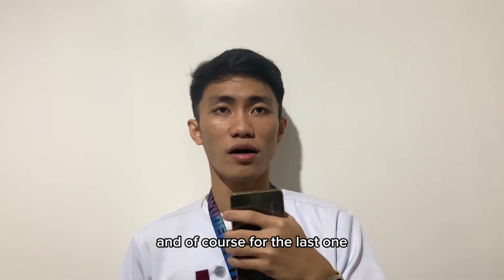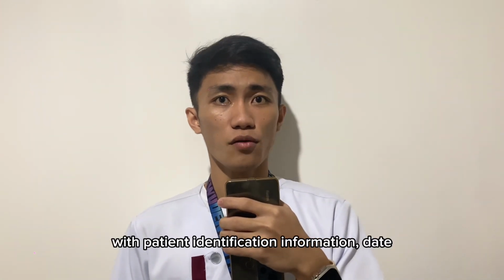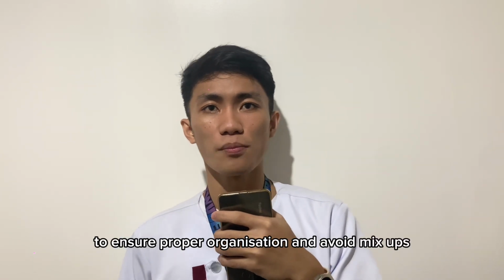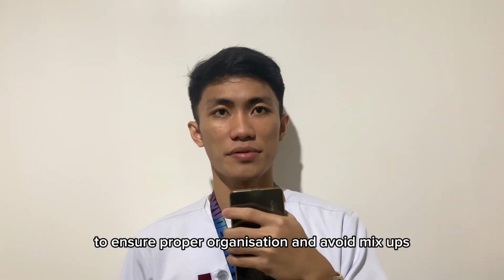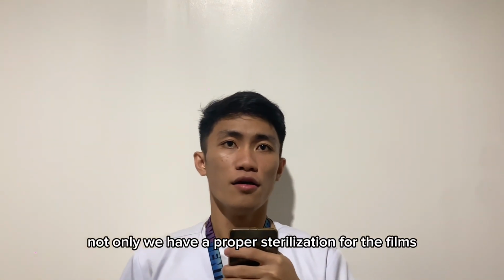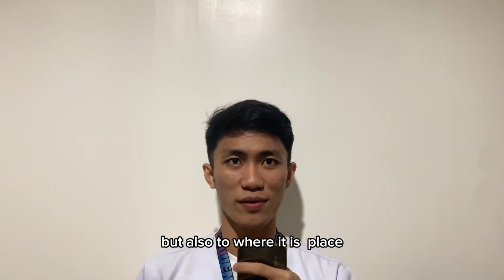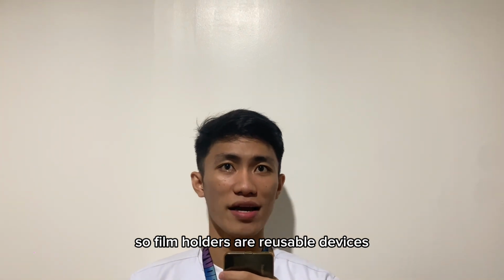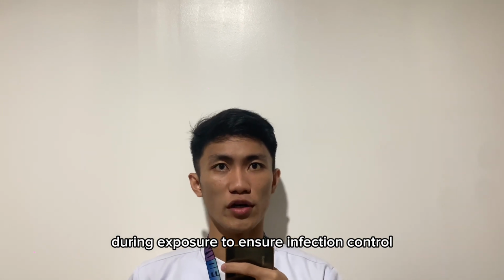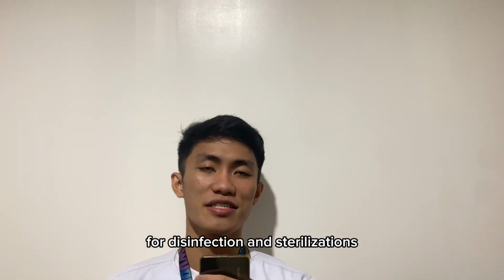And of course, for the last one, film identification. Clearly label each radiographic film with patient identification information, date, tooth number, or area to ensure proper organization and avoid mix-ups. Disinfection and sterilization of film holders. Of course, not only do we need proper sterilization for the films, but also for where they are placed. Film holders are reusable devices used to position and stabilize radiographic films during exposure. To ensure infection control, you must follow these practices for disinfection and sterilization.